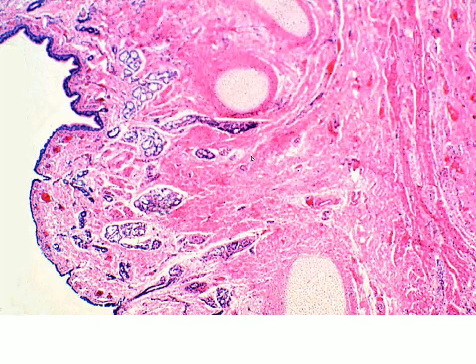So looking at the inset, we can see some smooth muscle that is moving into this area. We have many of our tracheal and bronchial glands that are going to be secreting materials. We can see some of the ducts of those glands right here. And then we've got our respiratory mucosa that we see lining the lumen of the trachea itself. And here we can see bits of that cartilaginous ring, the tip there as well as there.